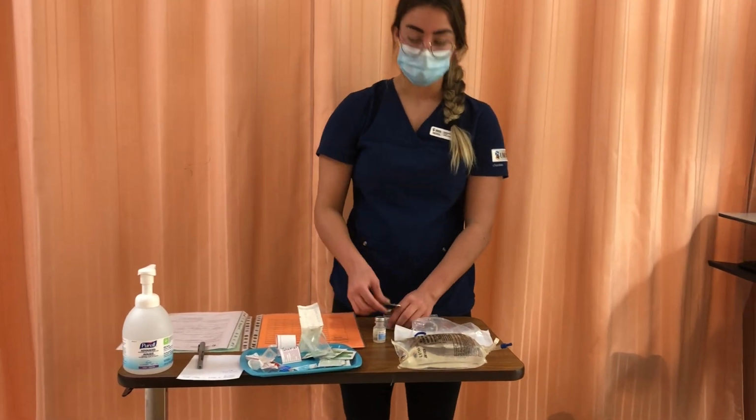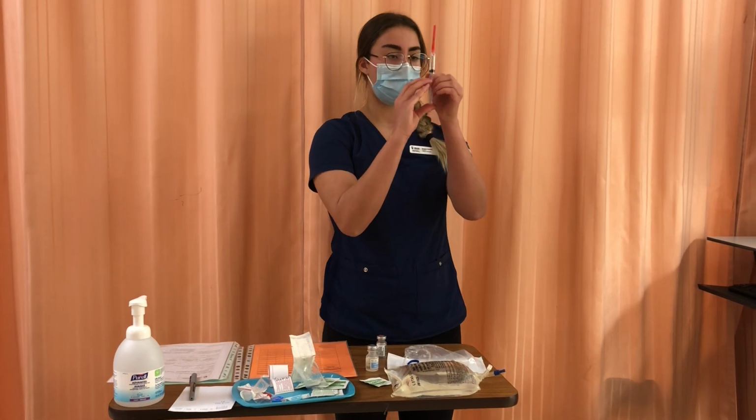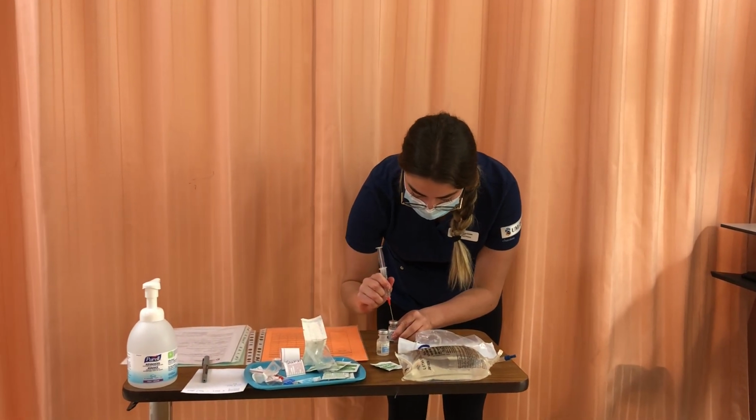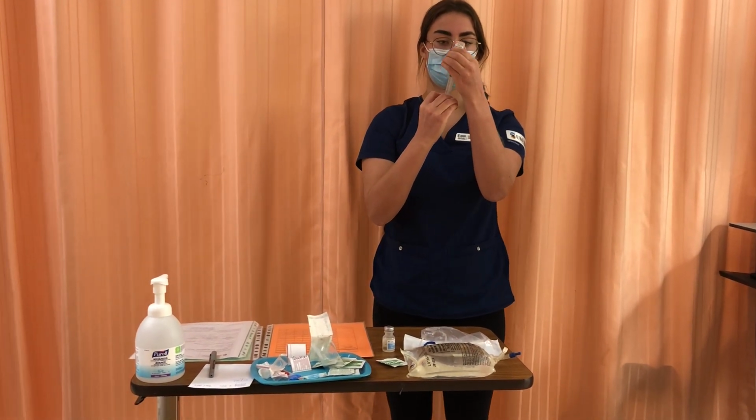So I'll swab the top of my vial again for 30 seconds, let it dry for 15, and I will inject 4 milliliters of air into my vial. I'll just do another one just to be sure.